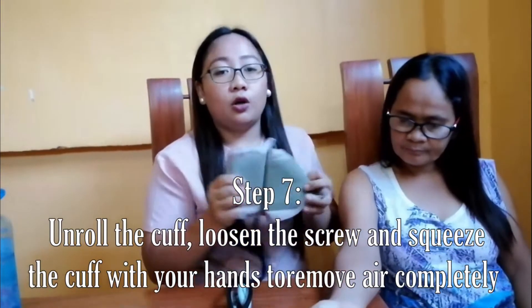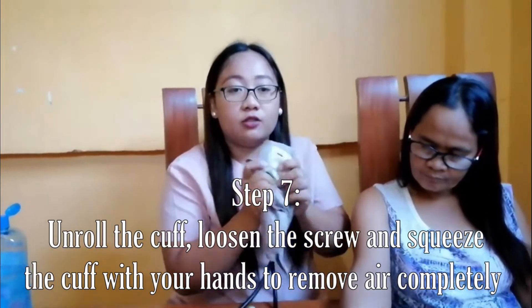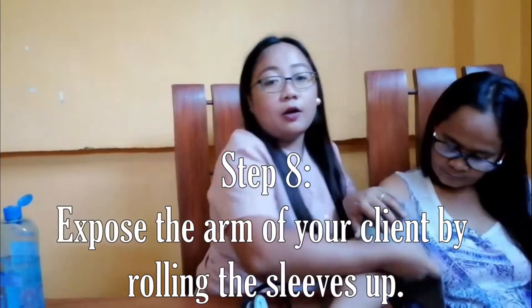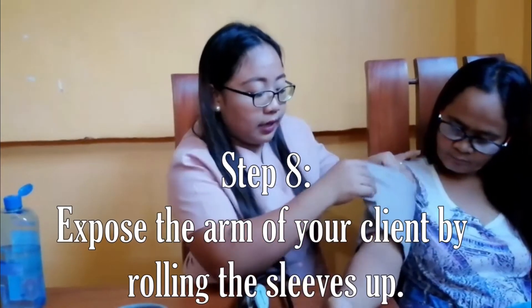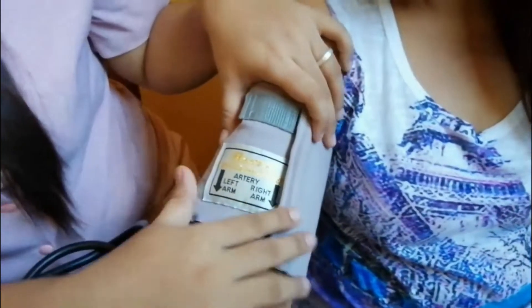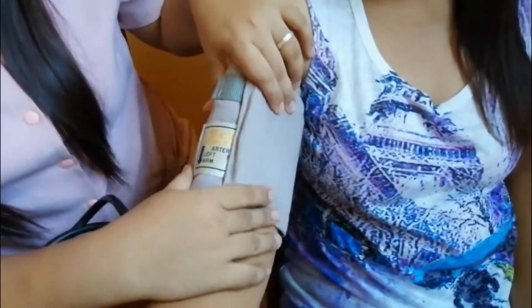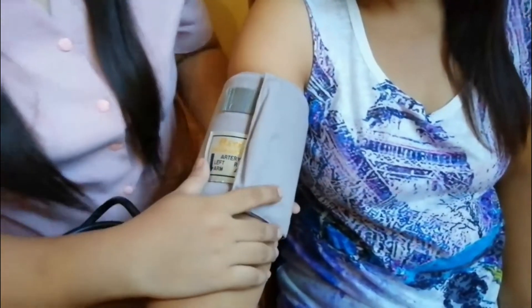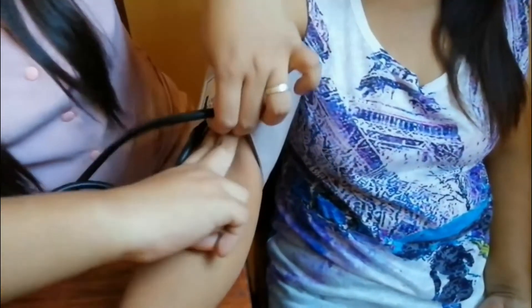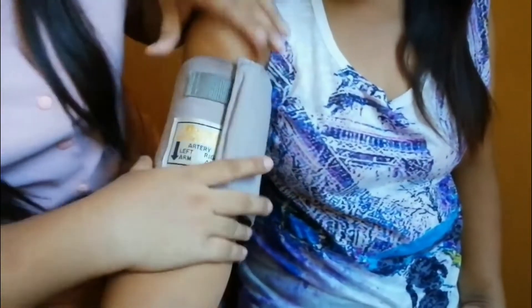Unroll the cuff and loosen the screw. Squeeze the cuff with your hands to remove the air completely. Wrap the cuff around your client's arm above the elbow — not too tight and not too loose. To check the fit, place your two fingers under the cuff. If they fit, it is perfectly fitted.